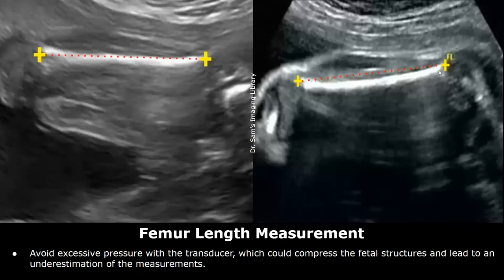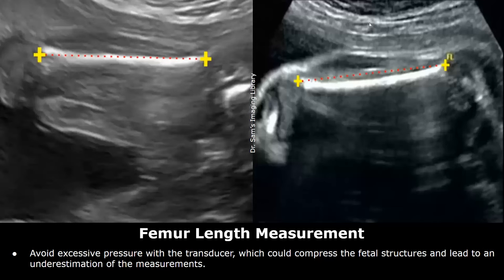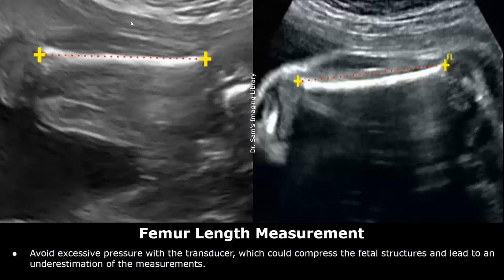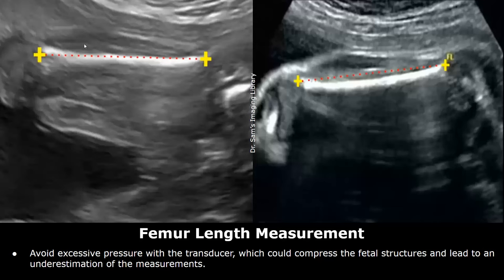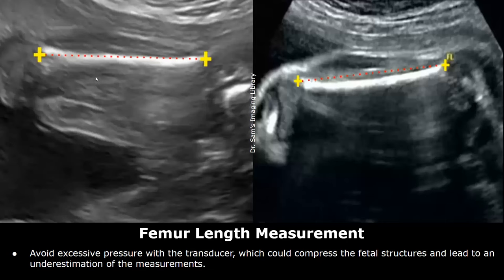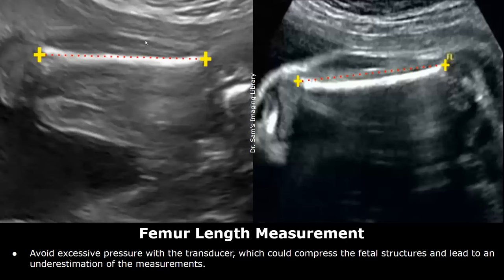Avoid applying too much pressure with the probe, as it can compress the fetal structures and give an inaccurate measurement.